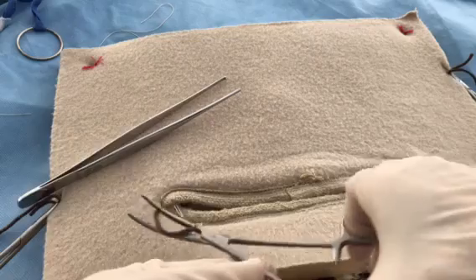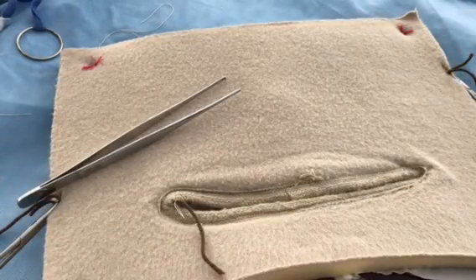And that's the end of this brief demonstration of a suture ligature.